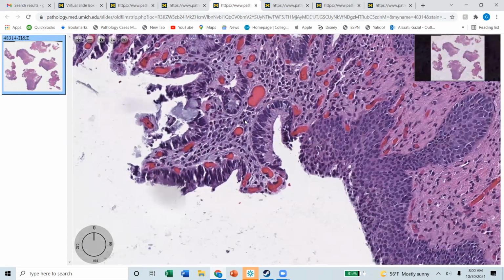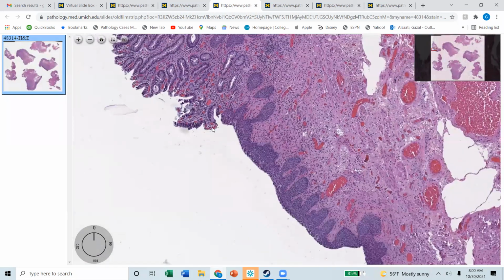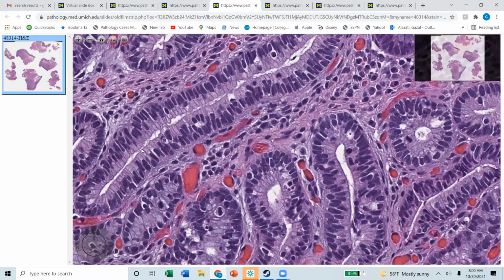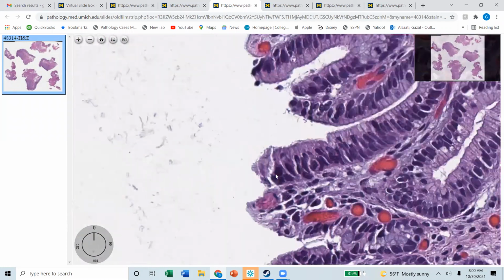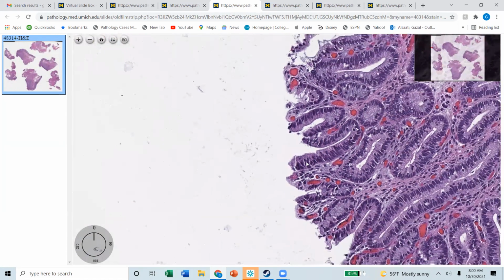Ooh, those nuclei are ugly in the glandular epithelium. I have pseudostratification in everything. But again, the one thing you have to keep an eye on is the surface. Here, see that? Okay, dysplasia. Why am I calling this dysplasia? Because my nuclei are switching from dots at the bottom to more long, reaching the surface. And after they become a long pencil shape, they're becoming rounded.